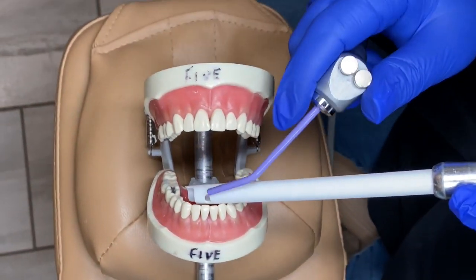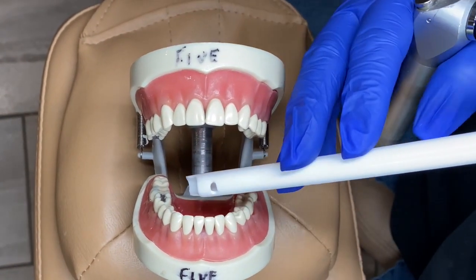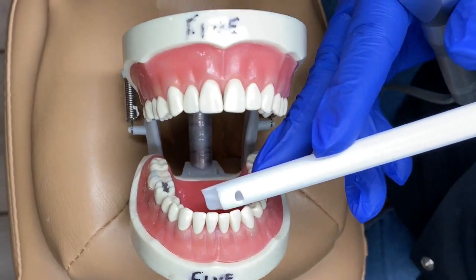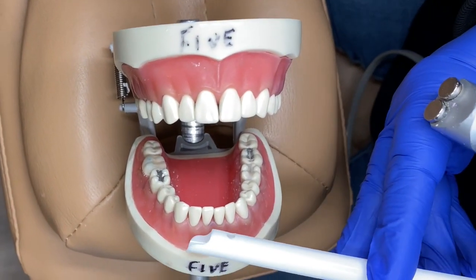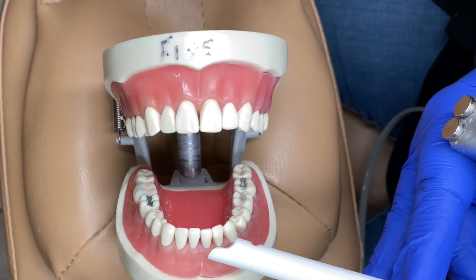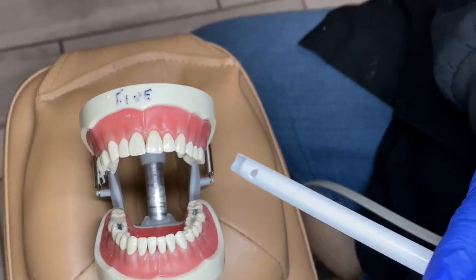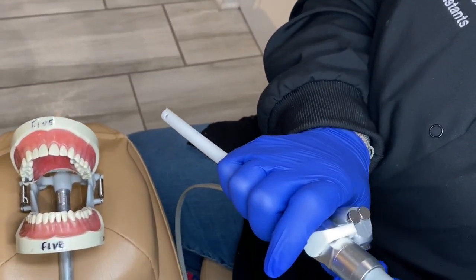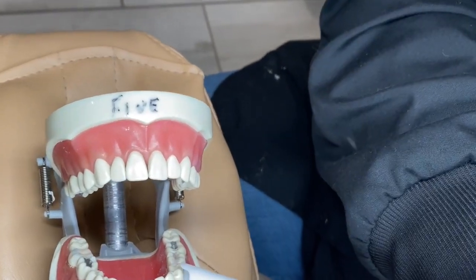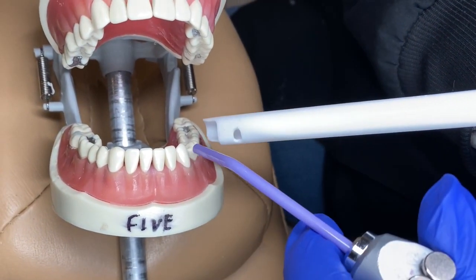Again, if we get in their way, they're just going to bump us — they just need us to move. Sometimes if they're on these edges, we'll either be here or come around to the facial and catch that water. Remember, don't push on the gums. All the way through here you can change hands if you need to, to come around. Remember your cheek — the cheeks are here, so you're just going to follow where the doctor is.